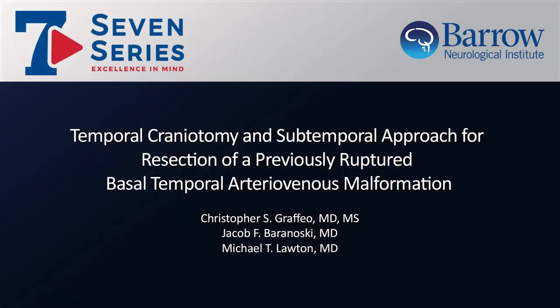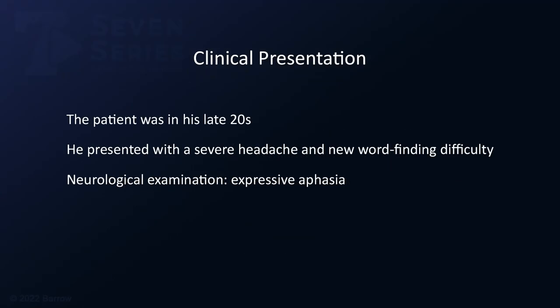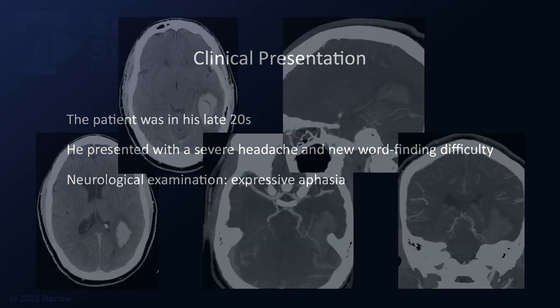This video will demonstrate the temporal craniotomy and subtemporal approach for resection of a previously ruptured basal temporal arteriovenous malformation. The patient was in his late 20s. He presented with a sudden severe headache and new word finding difficulty. On exam, he had a profound expressive aphasia.